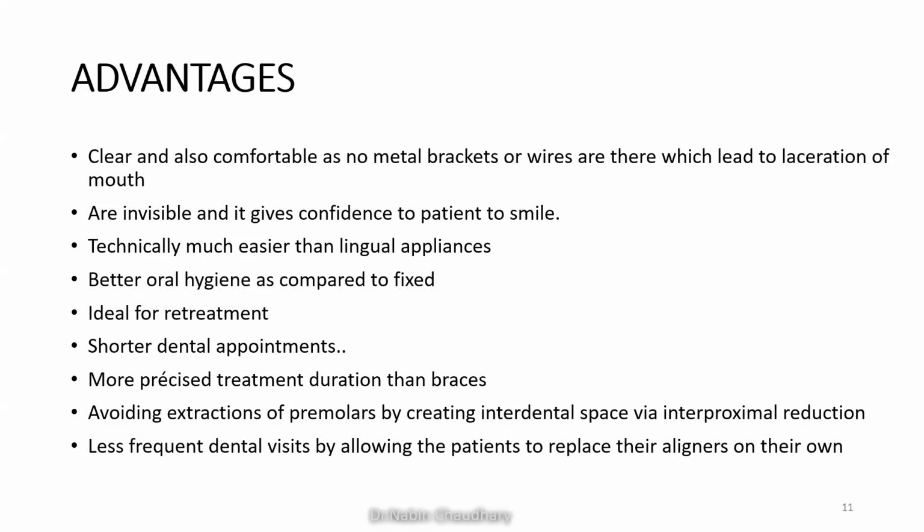And also, it is technically much easier than the lingual appliances. And also, since it is removable, better oral hygiene can be performed. And also, the clear aligners are ideal for the retreatment. Also, it has a shorter dental appointment, because the aligner can be directly given to the patient without the dental visit.